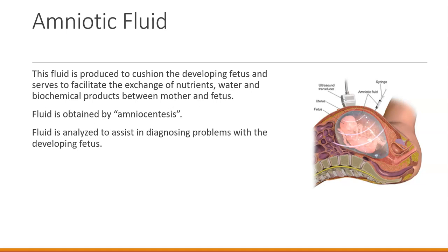The fluid is analyzed to assist in diagnosing problems with the developing fetus. It can be used for genetic testing. It can be used for chemical testing to determine different types of diseases that may be present.